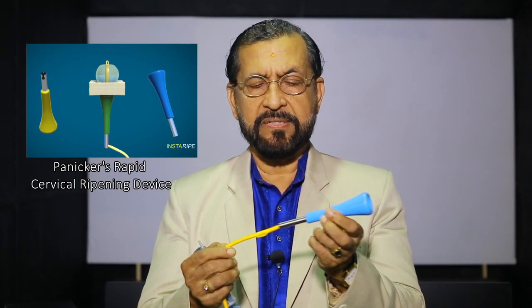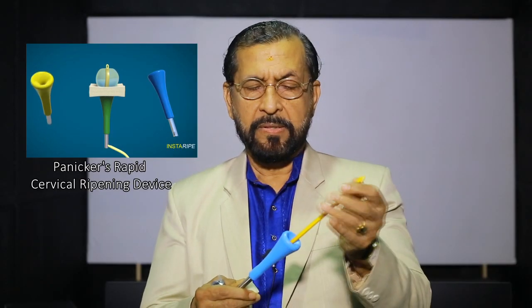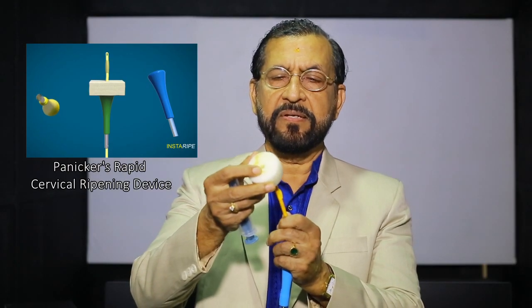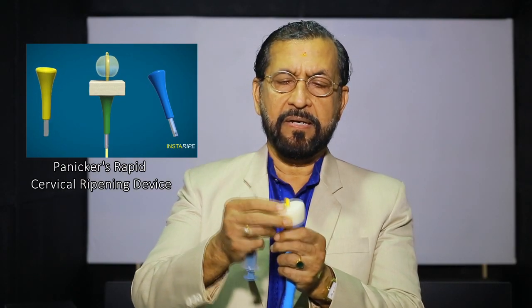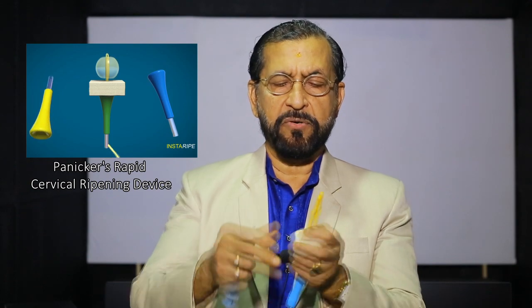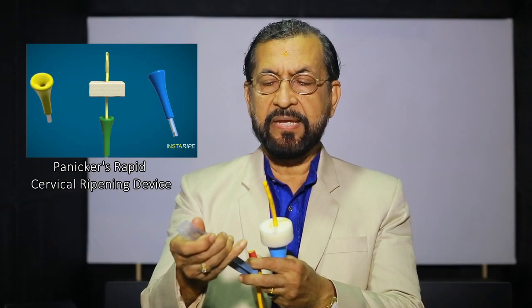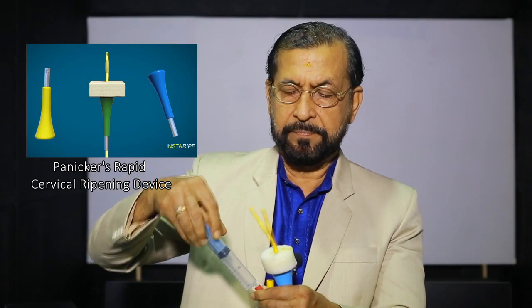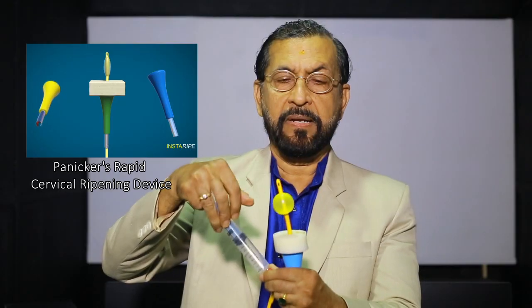The Foley catheter can be passed through this device like this. Then the Foley catheter can be passed through the cervical canal into the extra-amniotic space. This sponge represents the cervix. Like this, it reaches the extra-amniotic space. Now, the Foley catheter bulb is distended with 70 ml of saline like this.